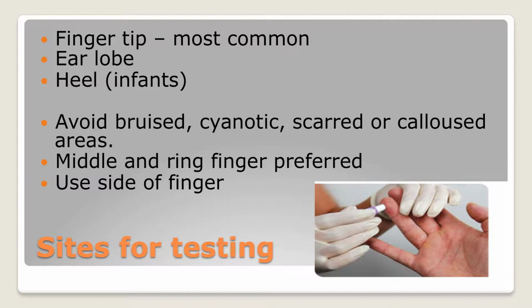If the area is already bruised, if it's cyanotic, if there's scarring, if it's calloused, don't go there. You're not going to get an accurate reading. It's going to be difficult to get, and it's not going to work well.